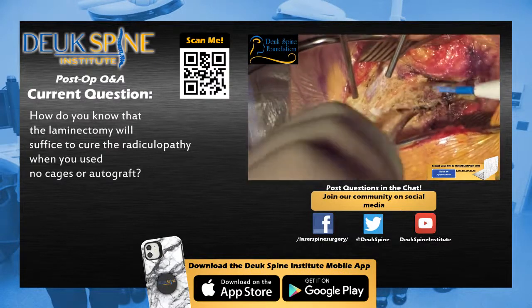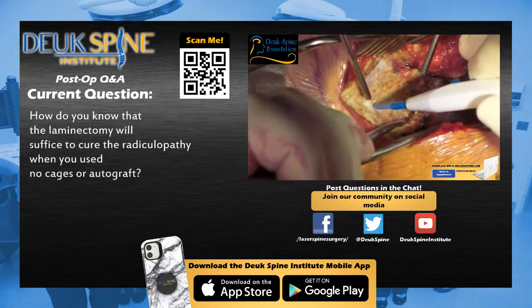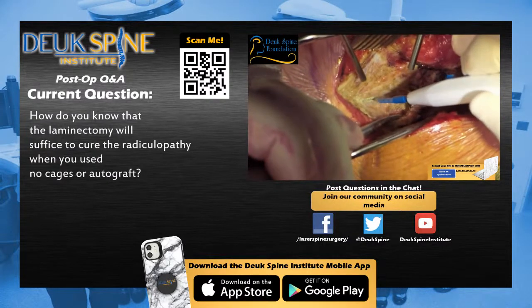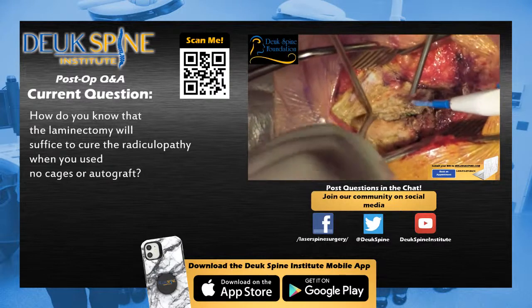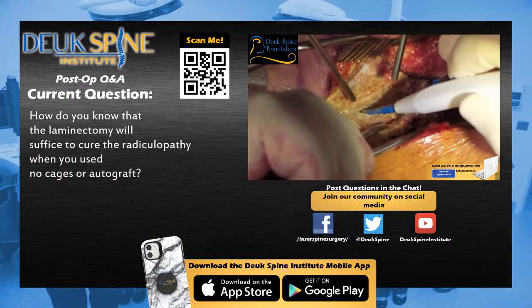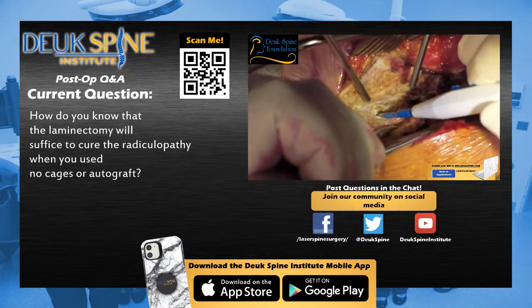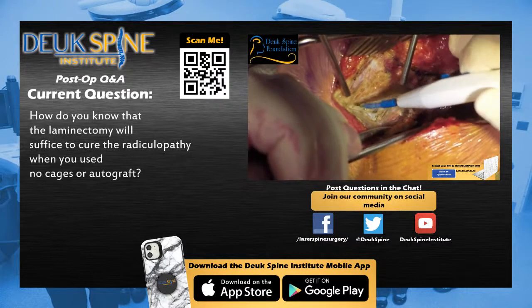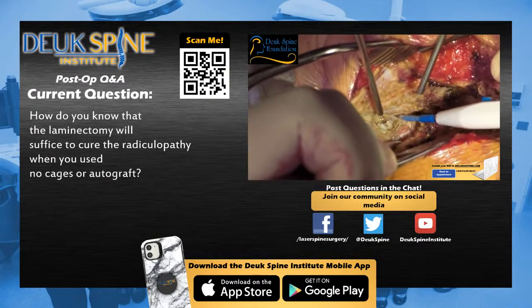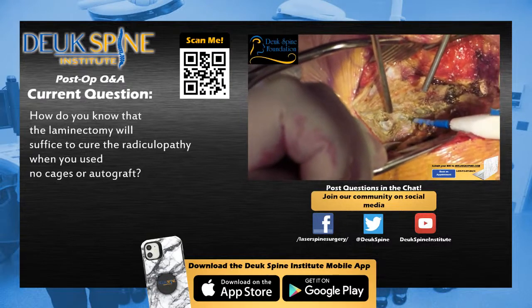We knew ahead of time that the nerves were being pinched in the foramen by the narrowing of the foramen in the back by the ligament that was pushing on the nerves, which we removed, the ligamentum flavum, as well as she had a short pedicle, so it basically brings the lamina closer to the nerve root because the pedicles were short. She was born with short pedicles. And so we removed the lamina in the back, and basically we know we've unpinched the nerve root.